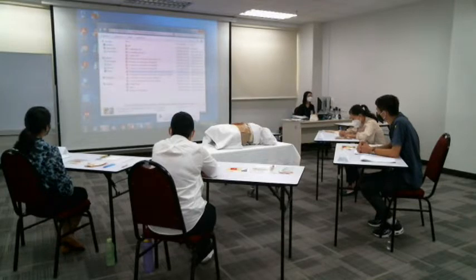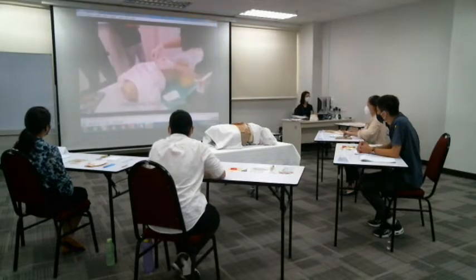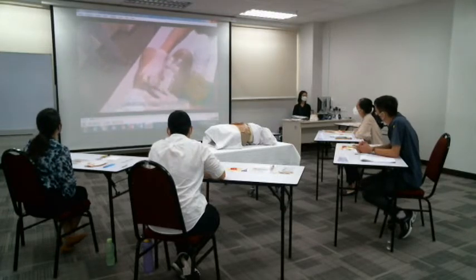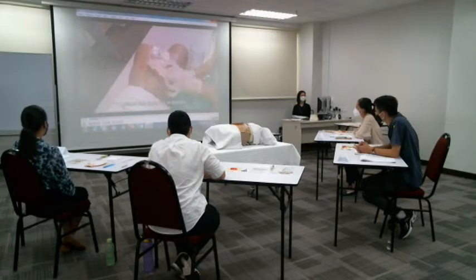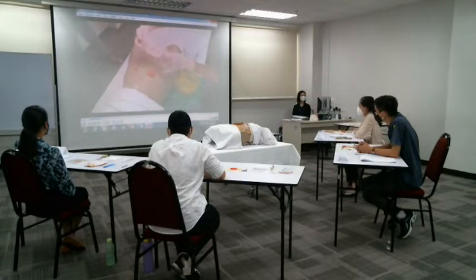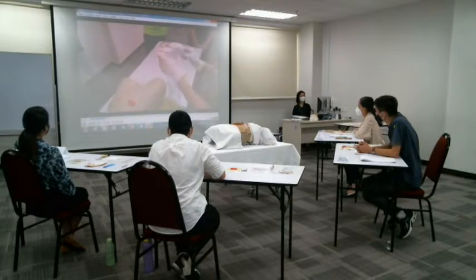So we are watching the video of the one piece system. If it is semi-solid, then you will measure it as a small amount, moderate amount, or large amount.